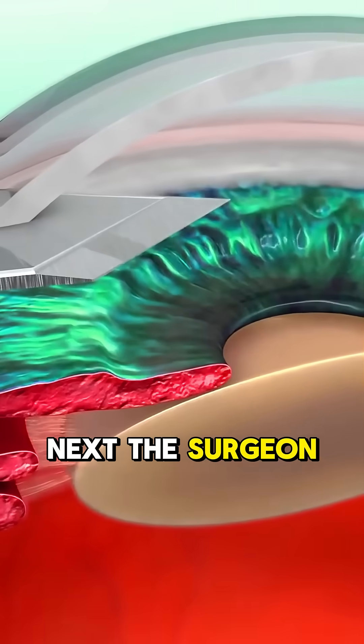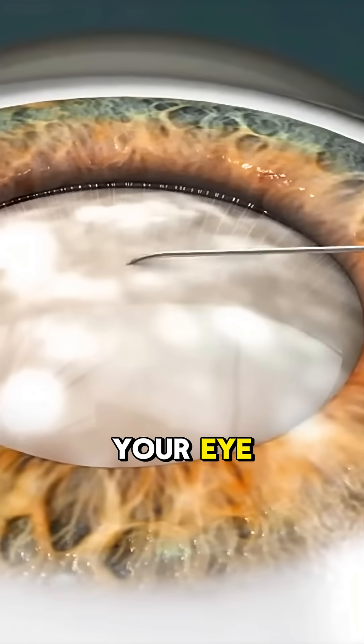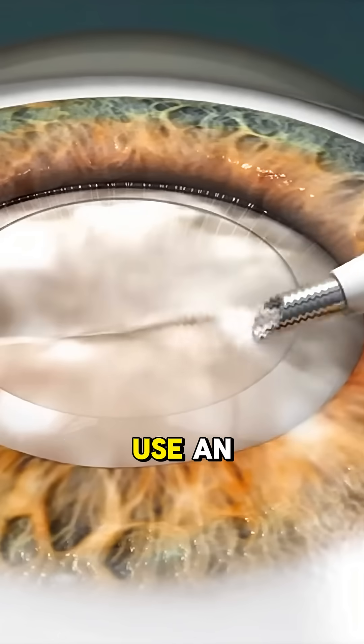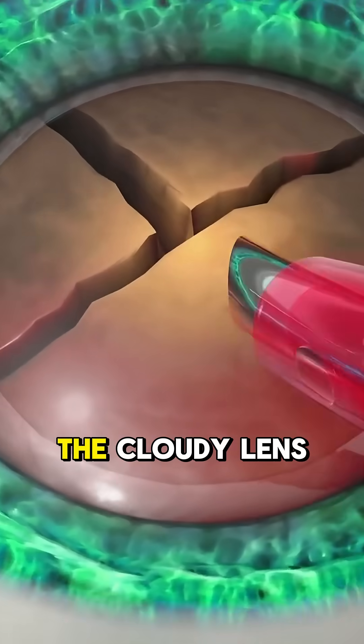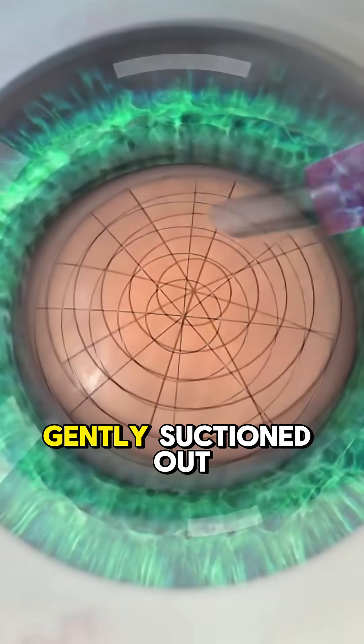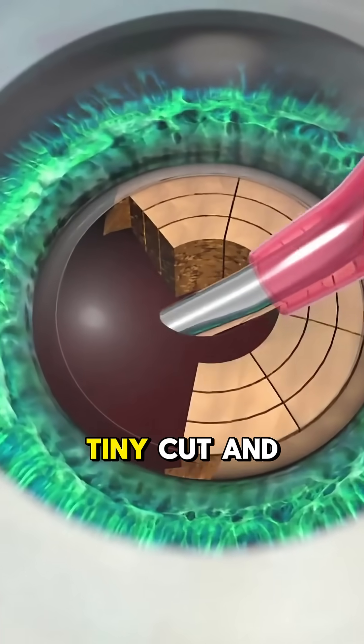Next, the surgeon makes a super tiny cut in your eye, smaller than a grain of rice. Then comes the cool part — they use an ultrasound tool to break up the cloudy lens into tiny pieces, which are gently suctioned out through that same tiny cut.